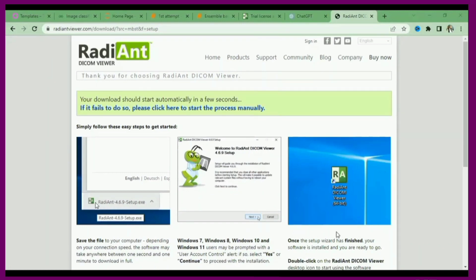It is a 30-day trial version, so if you want to use it for a long time you will have to purchase its commercial license. The software is now installed — I open it and I want to view a DICOM image stored on my computer.